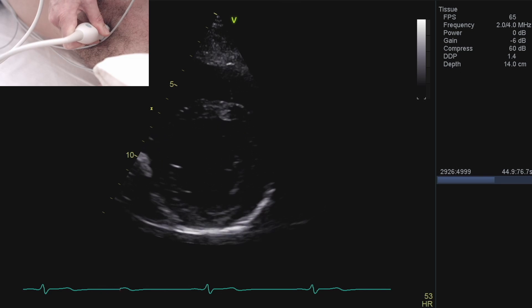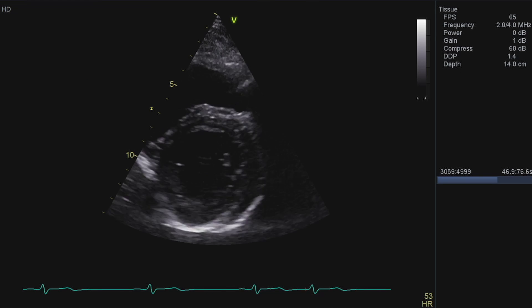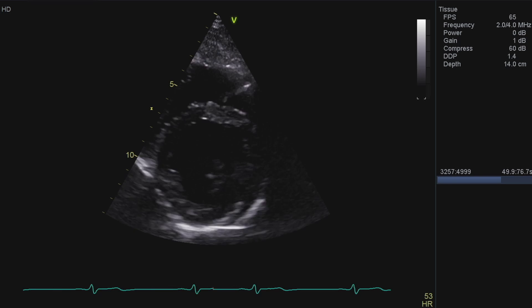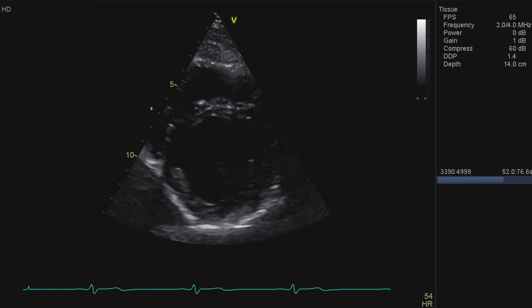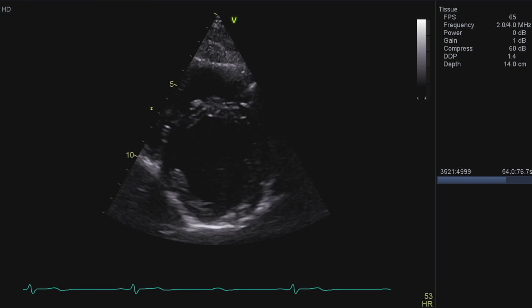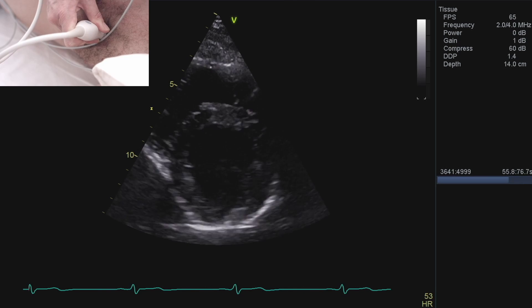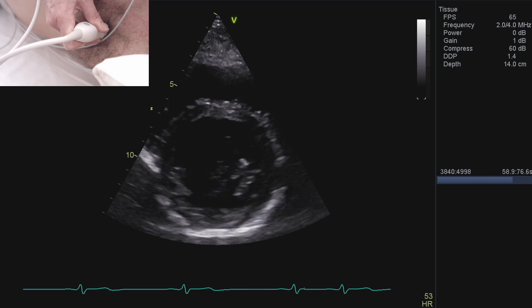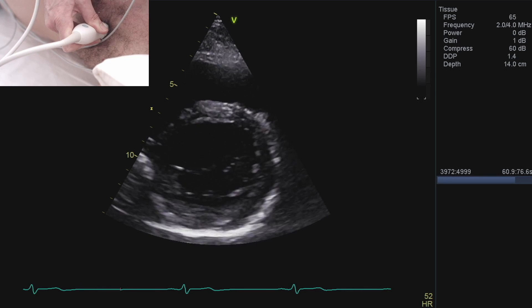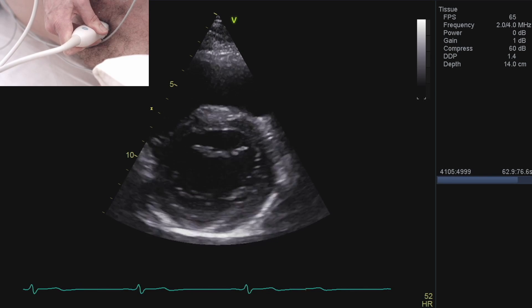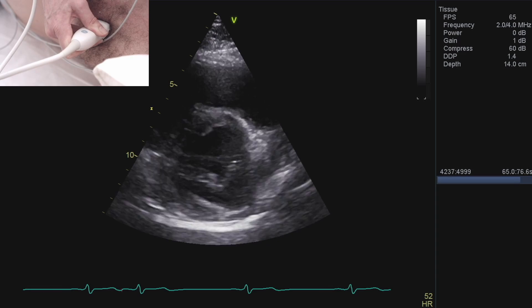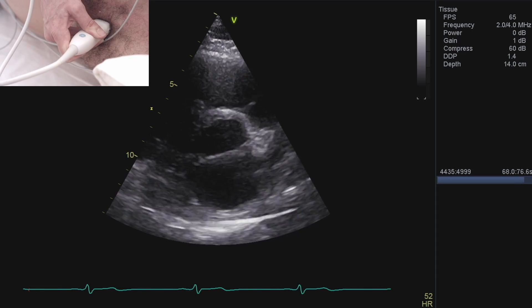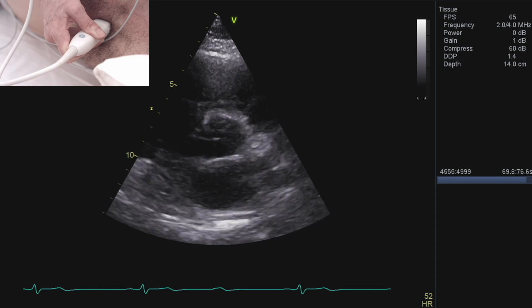That's a nice view through the left ventricle in the short axis view, but I want to start off with my aortic parasternal short axis view. So I'm going to angle up very slowly — tiny movements — going anteriorly and going up. Keep going, tiny movements. And there you can see the aortic valve coming in there beautifully.